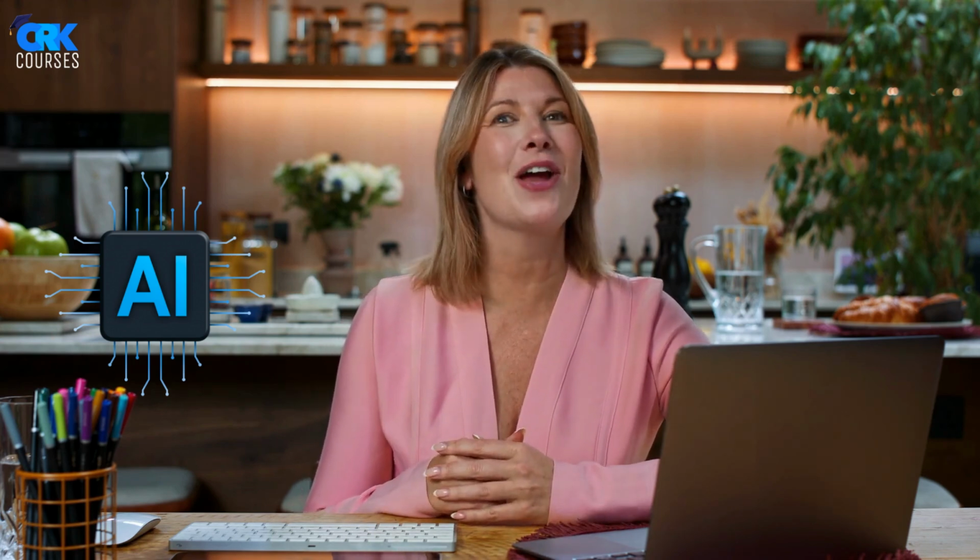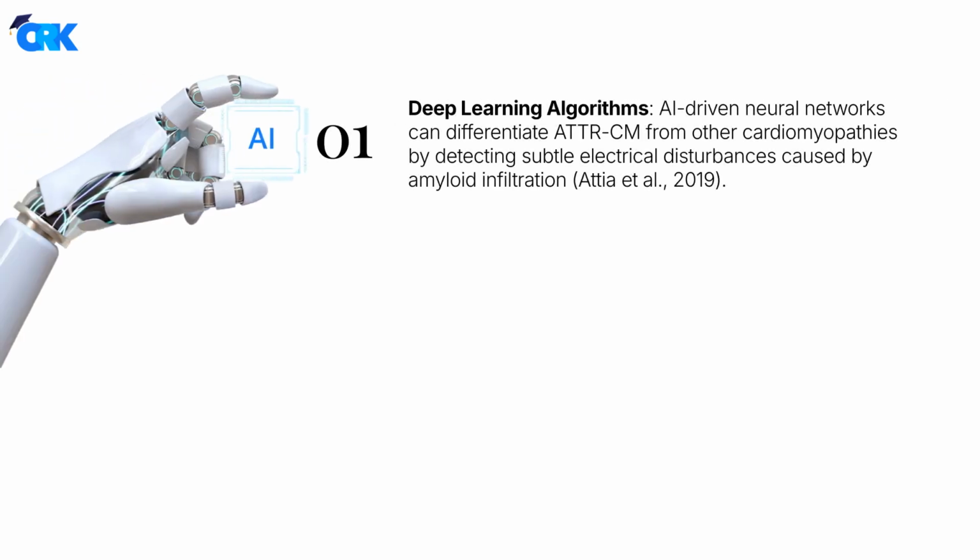So how does AI help? First, deep learning algorithms analyze thousands of ECG variables simultaneously. These models can distinguish ATTR-CM from other types of cardiomyopathy by recognizing the unique electrical signature caused by amyloid infiltration.